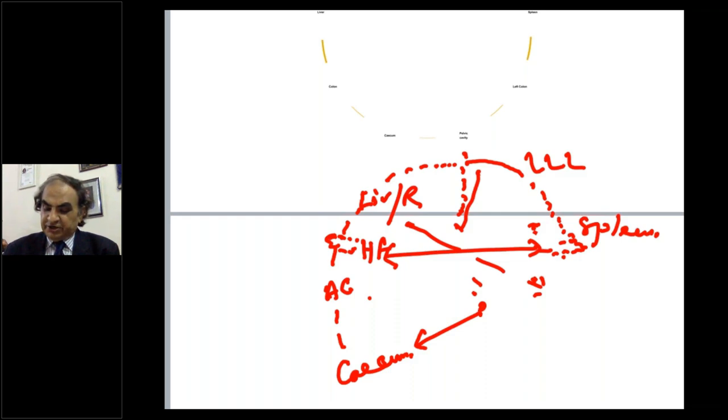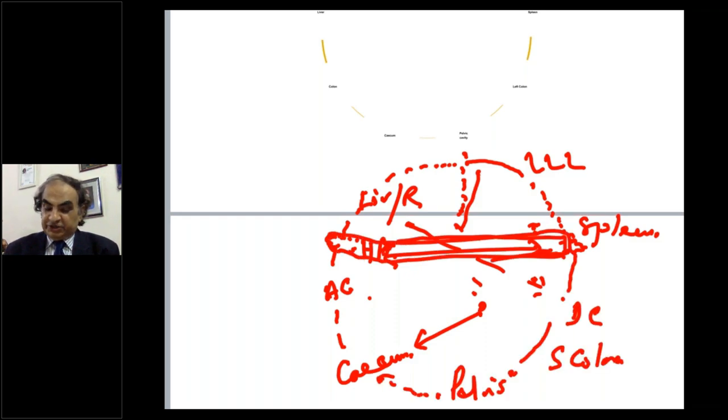Now the position changes for the pelvis. I'll get into the pelvis in a surgical scenario at the end. And for this, we need the Trendelenburg position of 30 degrees. So the bowel all moves upwards, right? And you're able to see the rectum. The sigmoid won't move. The sigmoid can be seen.